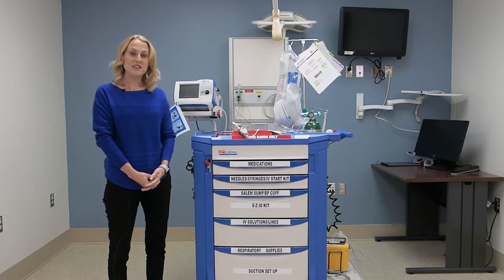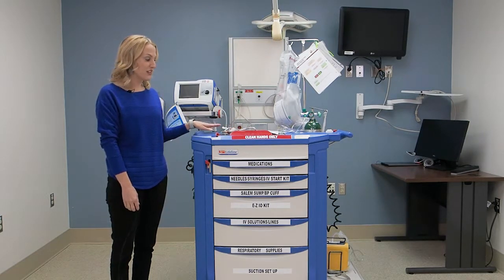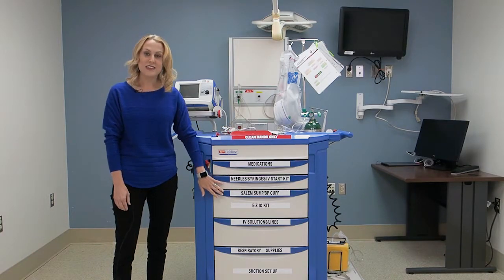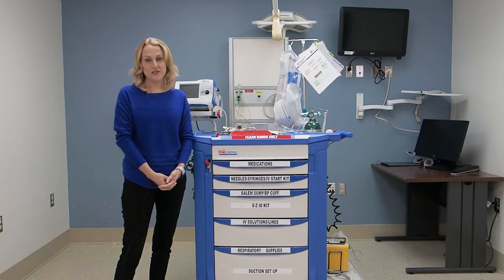I do want to start by saying our crash carts are all the same throughout our facilities, and they are made to be user friendly. As you can see, they are labeled, and that allows for ease for the user so that everything can run smoothly during a code event.